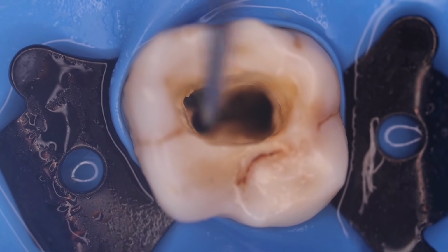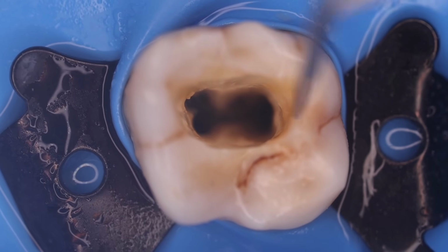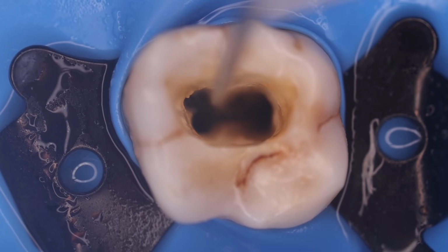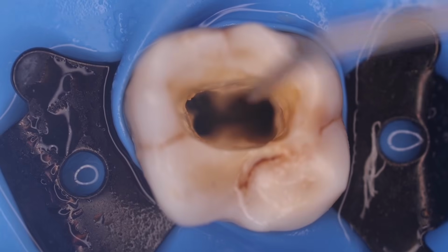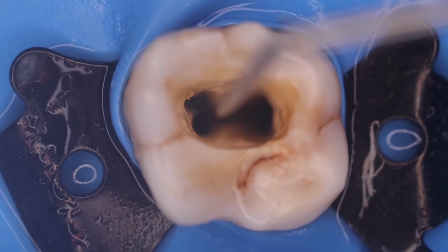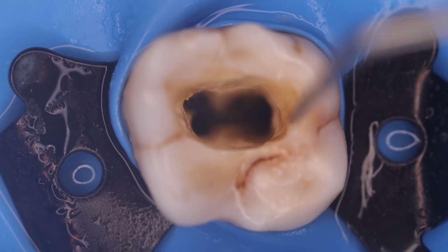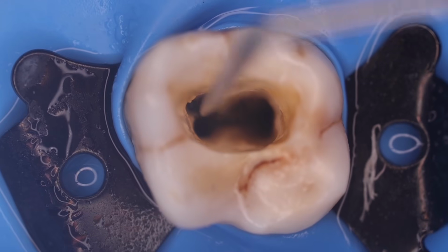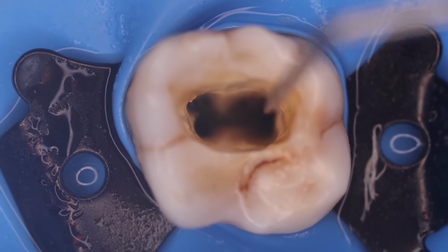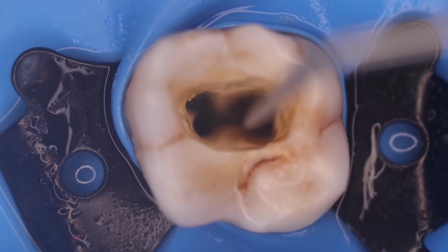In a direct access opening, or straight line access, we are able to see the canal orifices directly without tilting, rotating or angulating the mouth mirror. However, this compromises the coronal structure of the tooth, but has the added advantage of visualization of the canal orifices to allow proper treatment if we don't have the microscope and the CBCT.